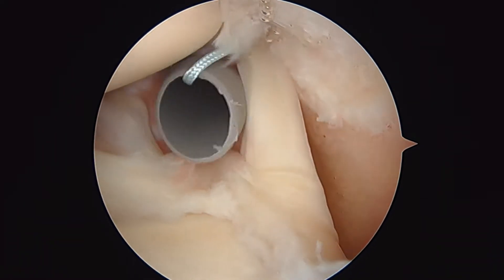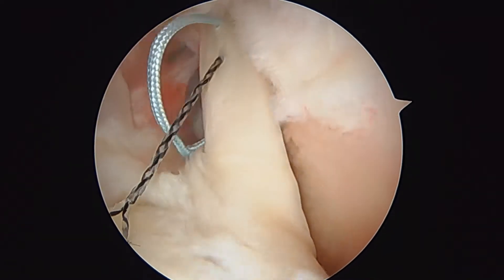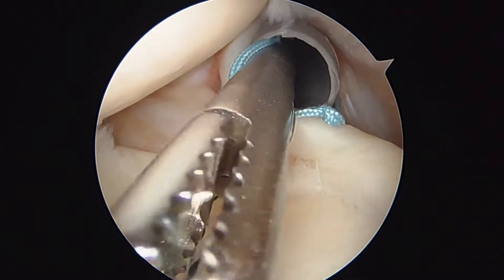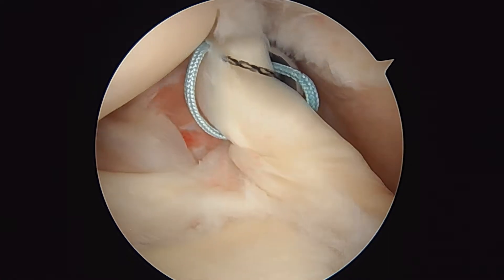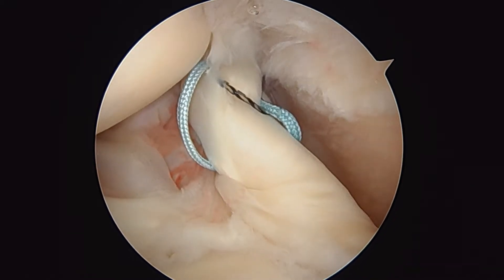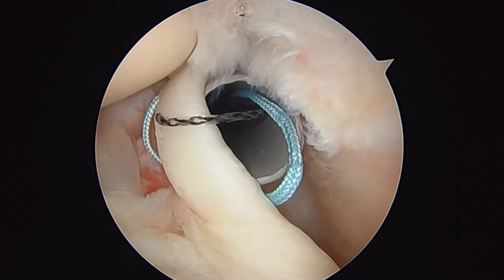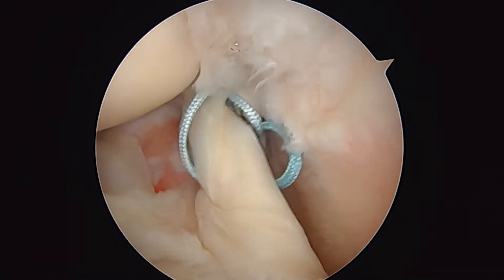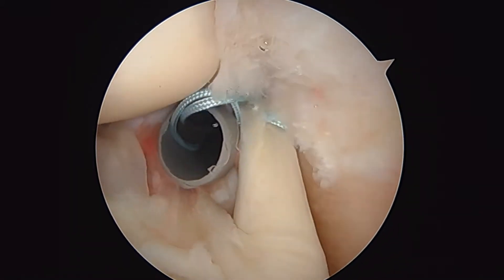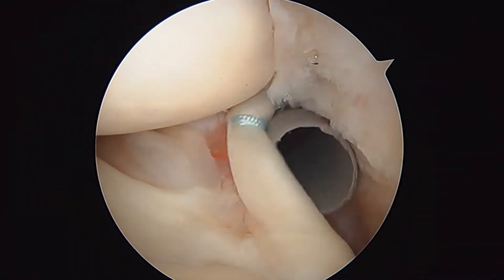We'll take the spinal needle back and a grasper back also. Now we've got the second wire pass — look how we're going to go behind the biceps this time. We'll retrieve the relay and load the relay one more time. You can see how that comes through. The reason we do it that way is because it gives us a purse string stitch around the biceps. You can see how when we pull tight on that suture, this gives us a very tight hold on the biceps tendon. I'm very happy with that.